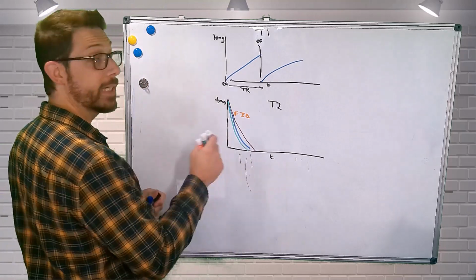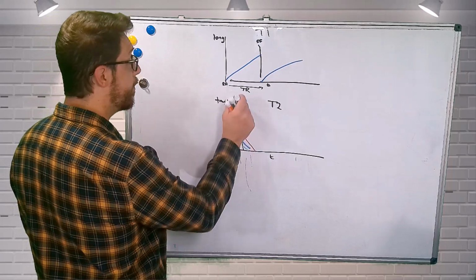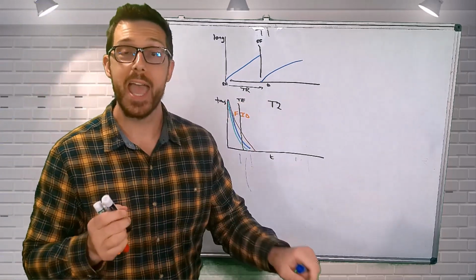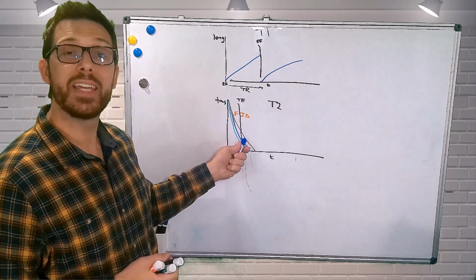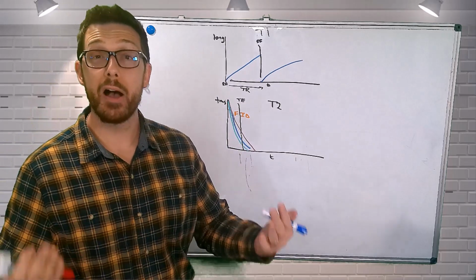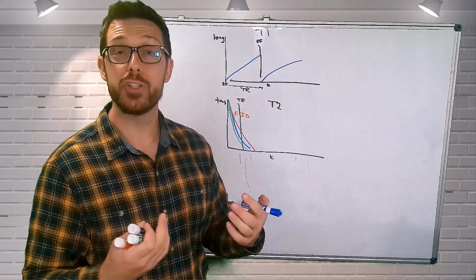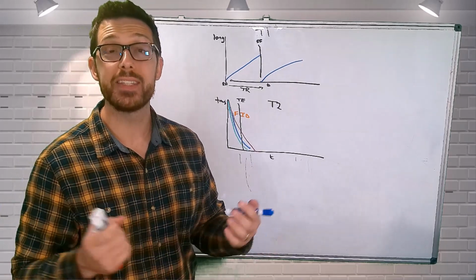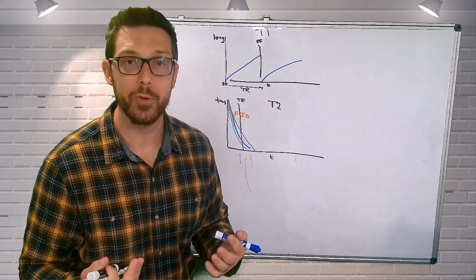So if I put a TE at a given period of time, and I collect all my echoes at that period of time, I can see that there's lots of variation between the decay of my transverse magnetization. And that's going to lead to variations in that T2 contrast that I collect. And that's the reason we call this T2 star contrast, because it's not completely accurate.